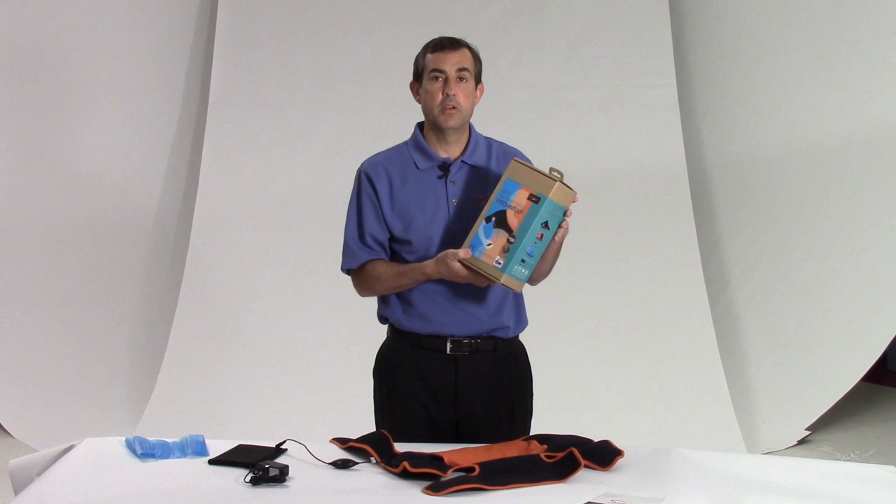Hi guys, it's Ryan from Roscoe. I'm here to tell you about the Thermetic brand shoulder 3-in-1 wrap. What makes it a 3-in-1 wrap? It has heat, has cold, and has compression from the wrap.